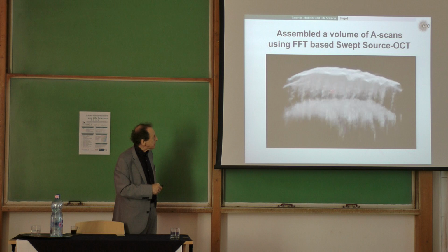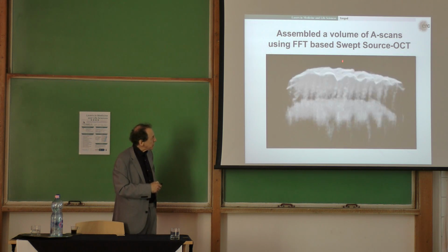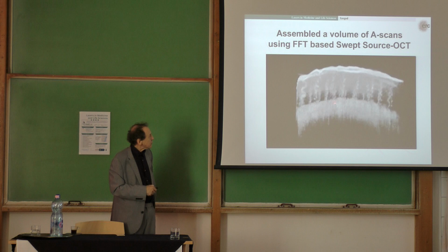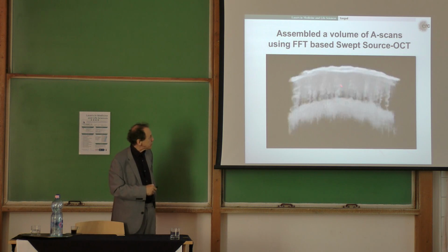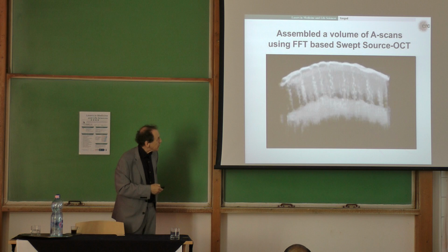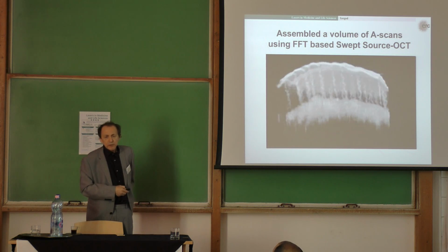These are helicoidal ducts. They take the water from the body and expel it out. These are the sweat ducts. So if you increase the temperature in this room, this will inflate to allow more water being expelled. You obtain such a volume in less than half second with modern technology.